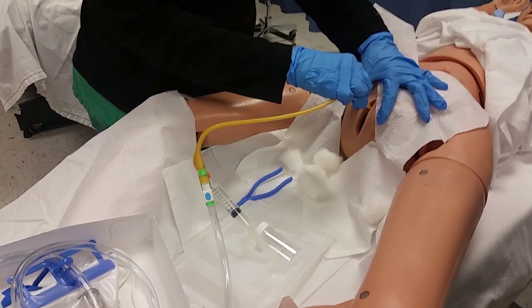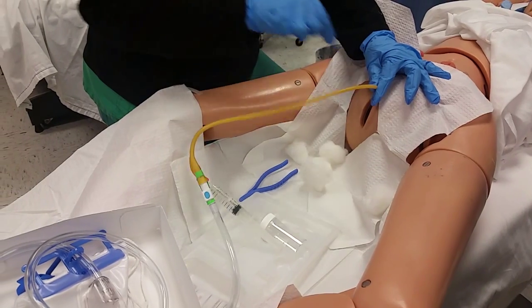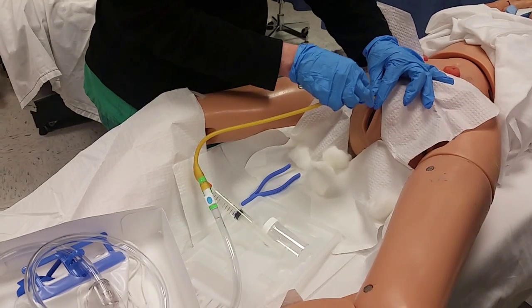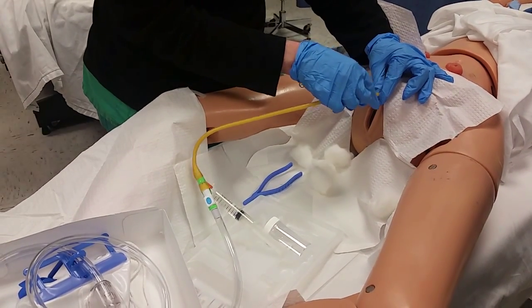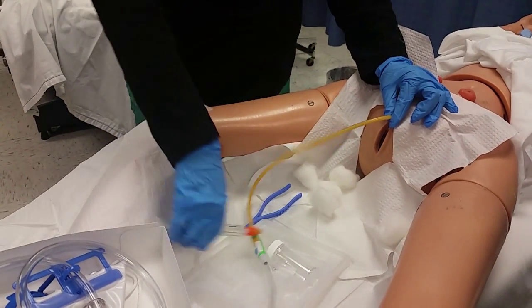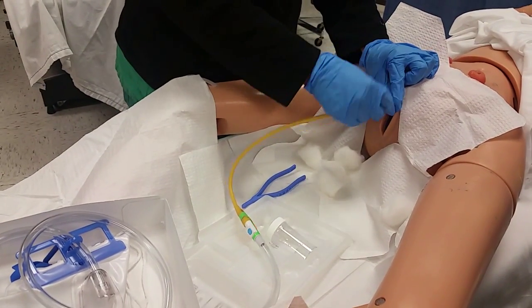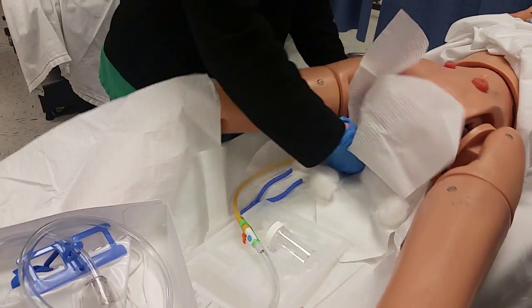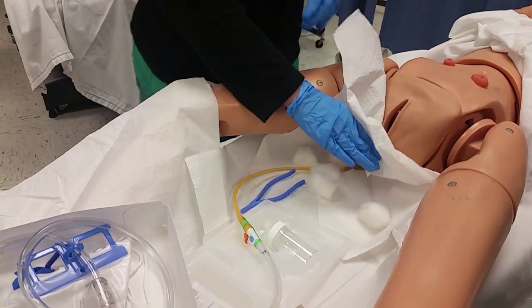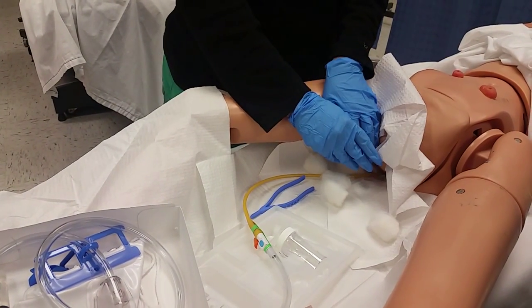So we've seen urine. You can let go with your right hand, grab this — you can grab this because you're already the way in. You're not going to take this catheter in any further. Blow it up, take the syringe off, and it is in. You will rip this — I always grab this and wipe the excess betadine off. Rip it so that they don't get a betadine burn.